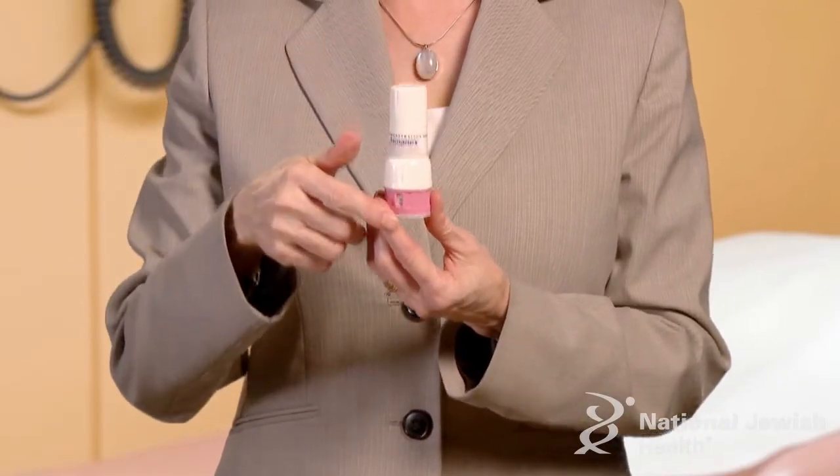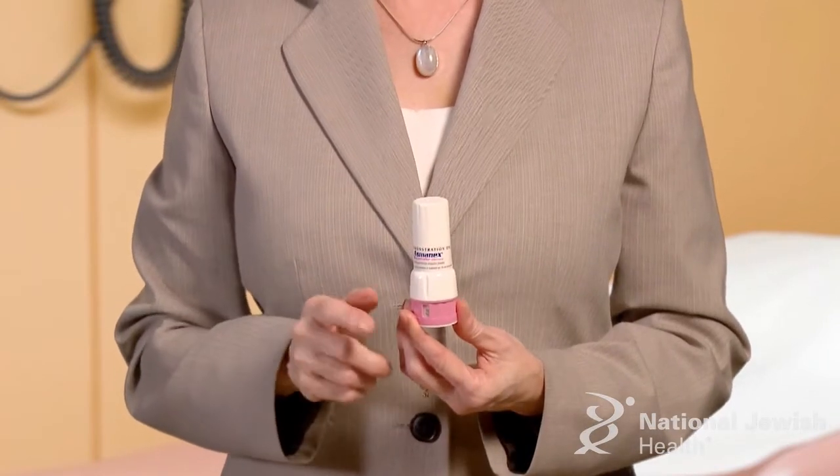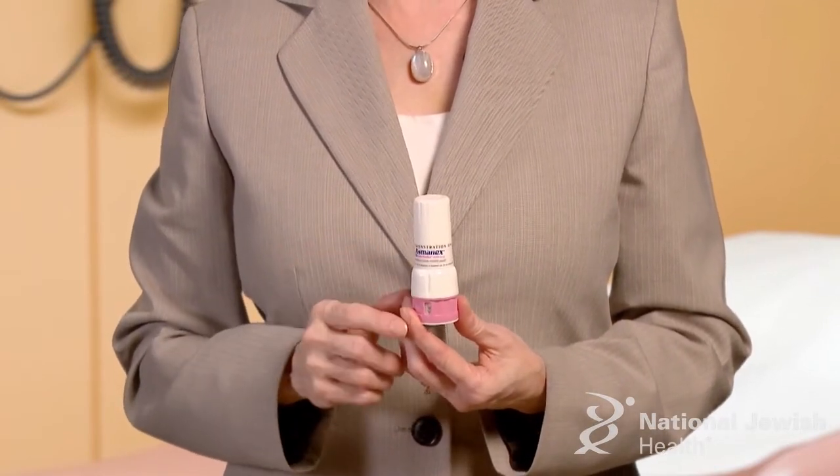To open the twist hailer, hold it straight up with the pink portion on the bottom. This is important to make sure the right dose of medication is loaded in the device. Turn the twist hailer cap to the left to remove it.